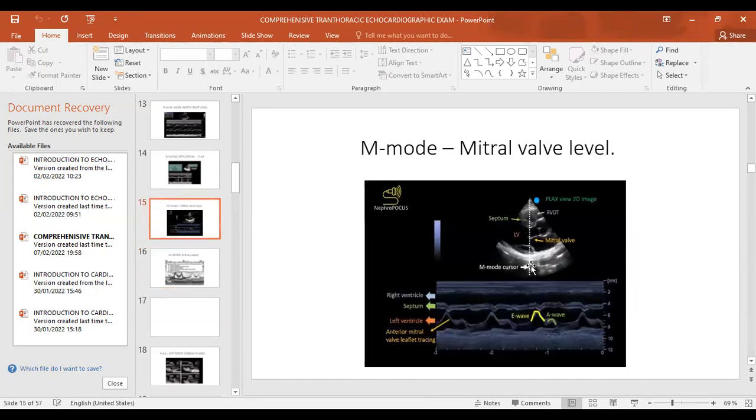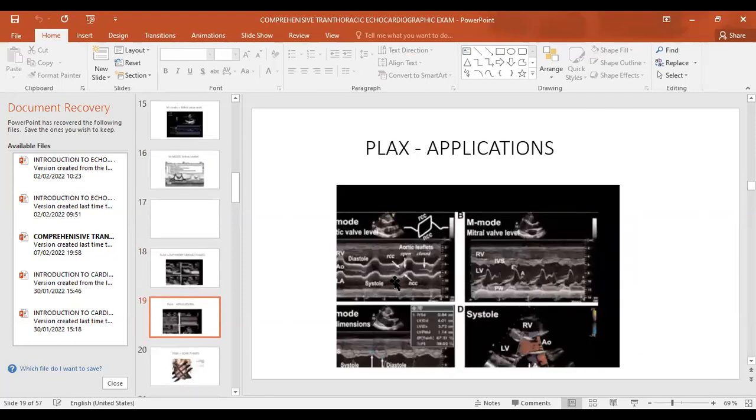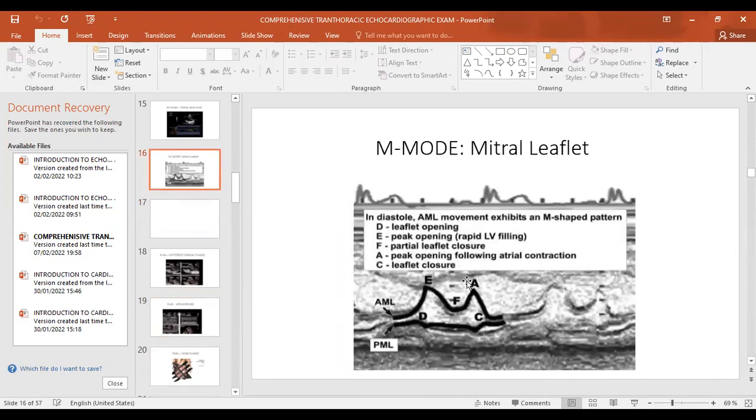Because of this, do I have this wave? You've seen this wave that is coming here. Some literature will tell you it is squeezed. This physiologically helps to squeeze the blood that is remaining in the left atrium, and it will completely squeeze, which we call the atrial kick. Now, this is the peak velocity.